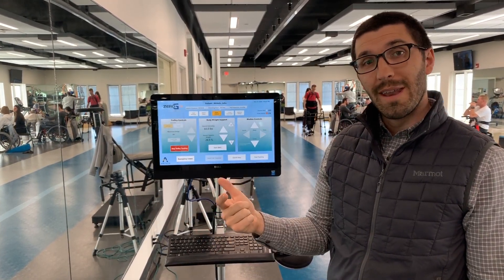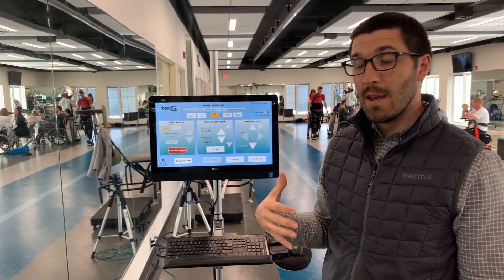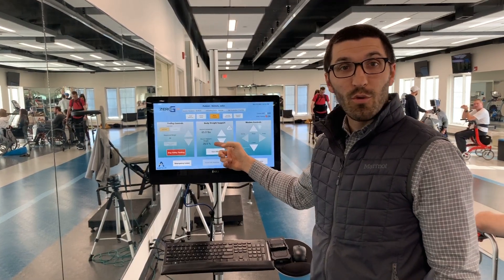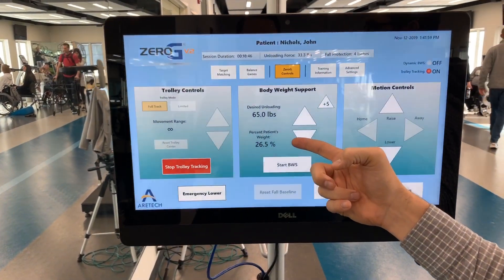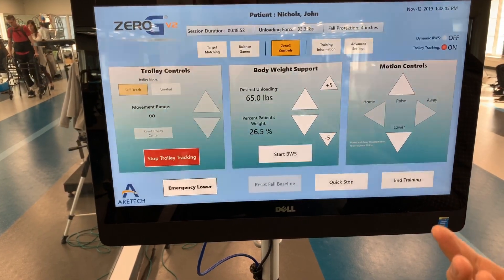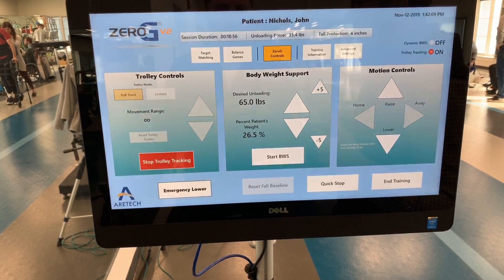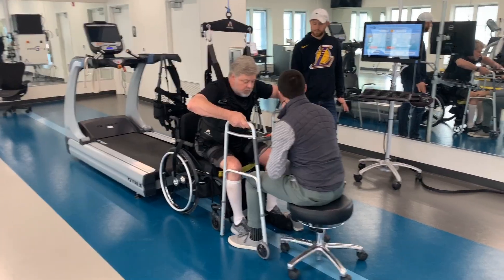So what we've done now is we've gotten him connected into the Zero-G. He has a harness on. You can see from right here he's going to have about 26.5 pounds of body weight support, so it's not a lot, but it's going to be just enough to provide him the necessary support. We'll notice that he's able to take some more fluid steps and go faster and get more repetitions in throughout our session. Let's do it.